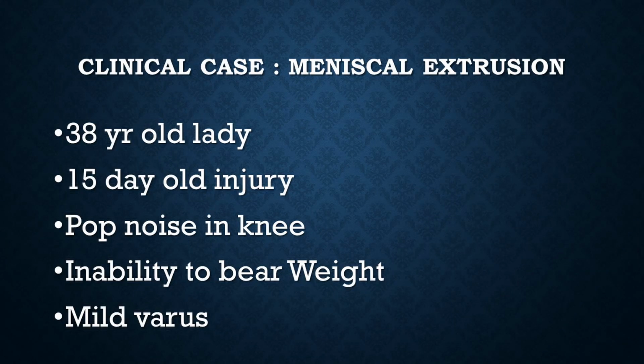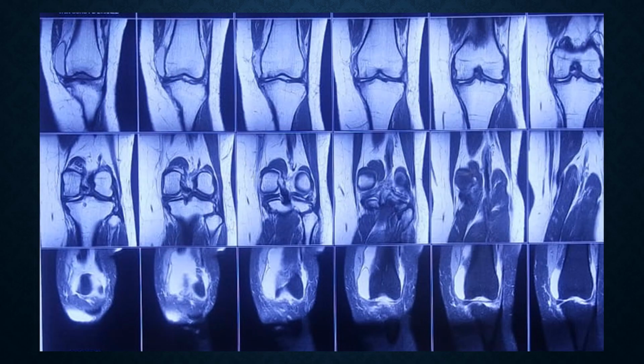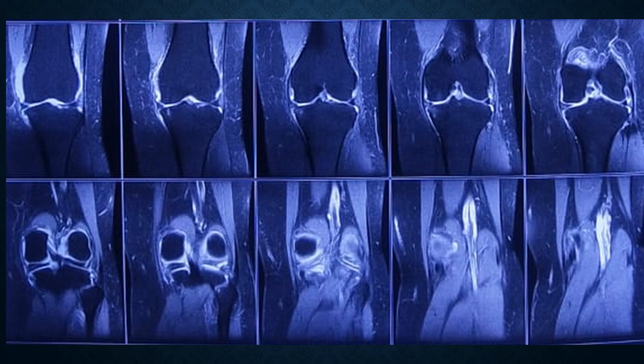We are presenting a case of meniscus extrusion in a 38-year-old lady. She sustained an injury 15 days ago and she had a pop in the knee and then had difficulty in bearing weight. If you see the MRI scans, you can appreciate that there is a significant meniscal extrusion, which is much more than expected for her age. All the signs, including the ghost sign and the extrusion sign, are positive.